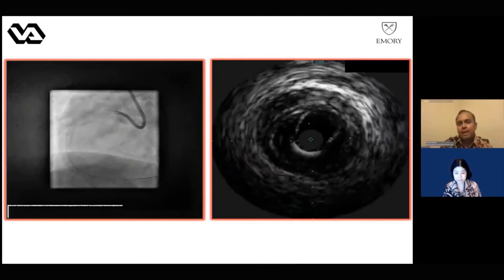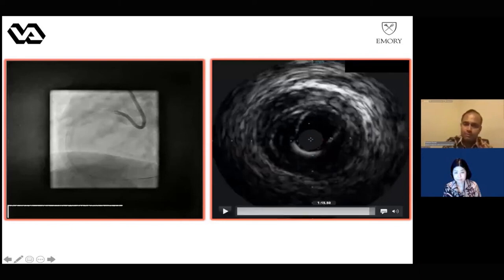So we have had some experience with this phenomenon. I have seen a similar appearance with orbital atherectomy, where I once had a perforation that had very similar behavior. And we have seen a few of these with intravascular lithotripsy as well. So we are seeing this with IVL. I figured this is something interesting that the panel and the audience might want to know.